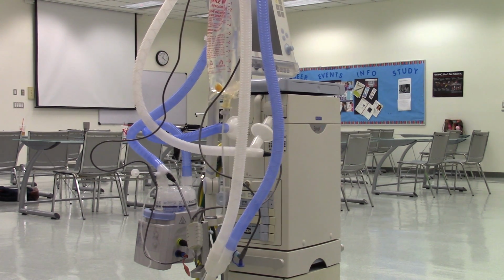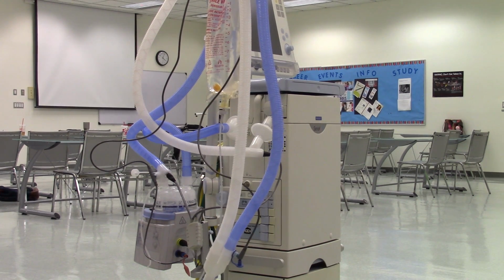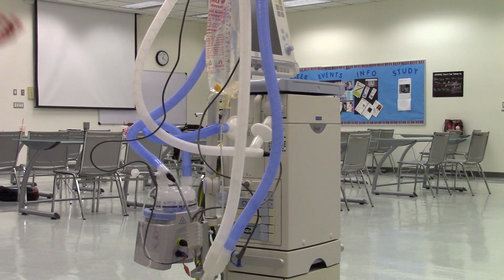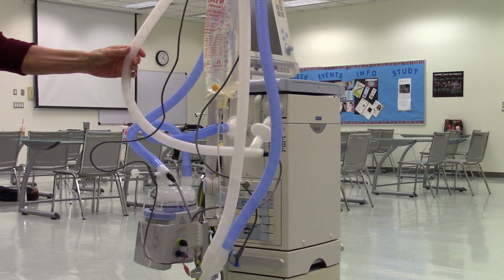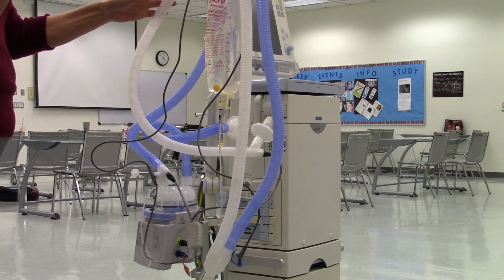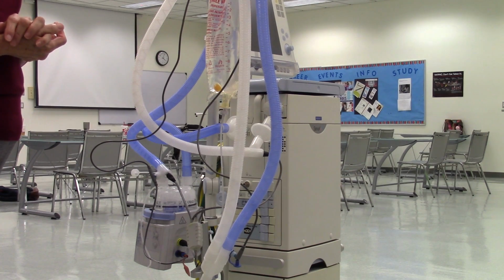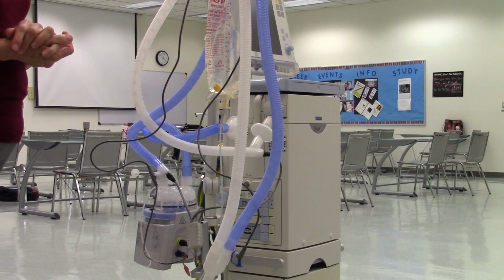So why does there need to be a wire for the expiratory side? The exhale gas also cools and you get condensation. Because it comes out at body temperature, and then if the room is cold, it cools off. And then when the gas cools, all the water will rain out. Right, and that causes some type of liquid inside there?